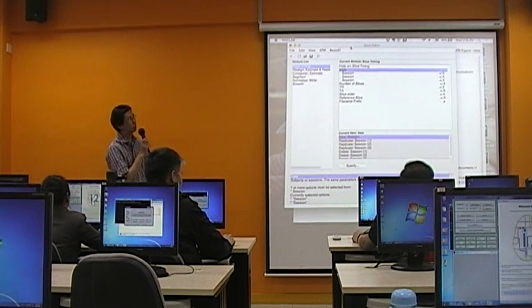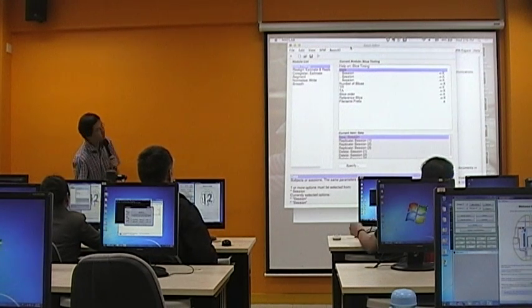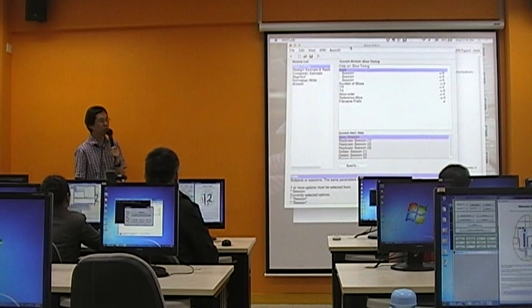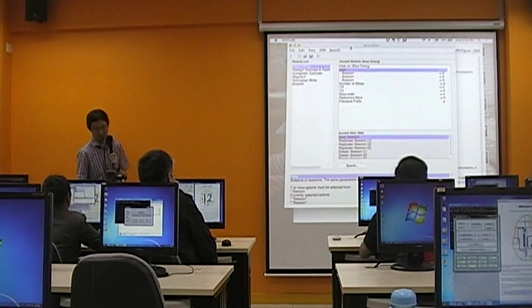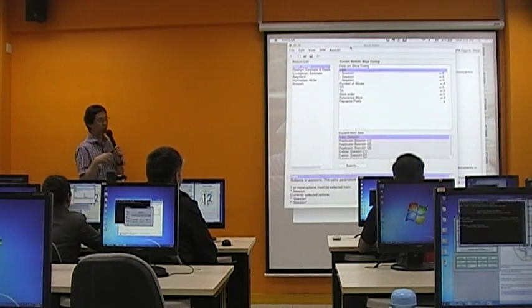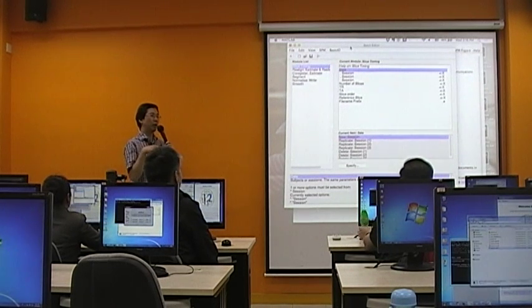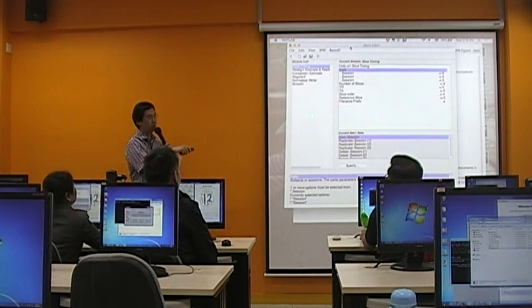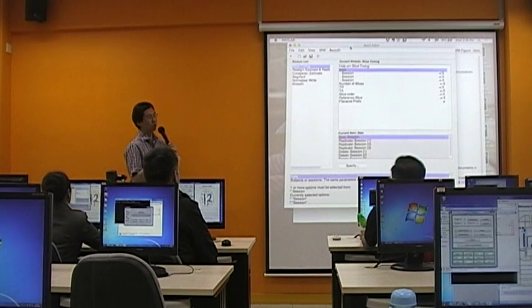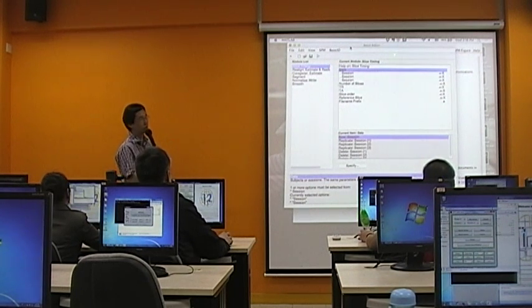First level and second level model, I just want to take some time to recap on some of the settings for pre-processing, because some of you have told me that perhaps the pace is a little bit quick. So just as a quick revision, because we don't need to spend lots of time. Anyway, I have already saved this pipeline into a Dropbox folder containing all the information. So you could have this file for your reference.